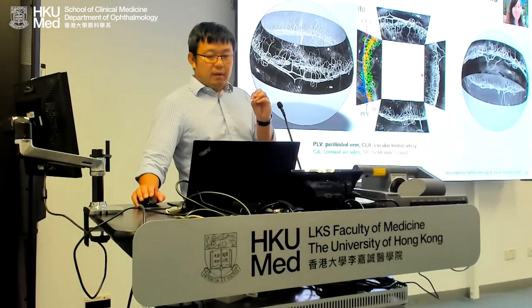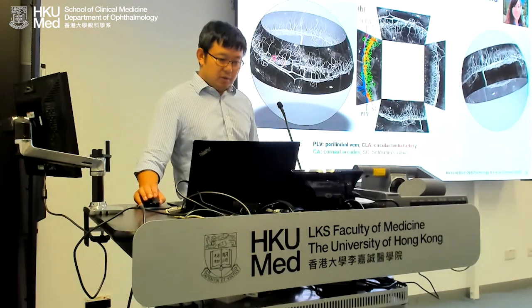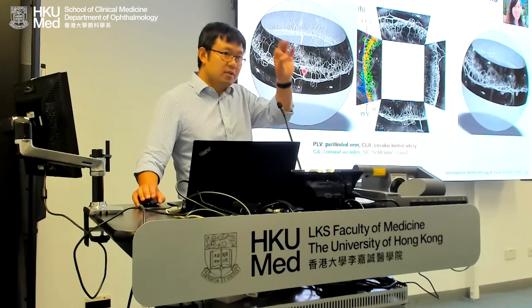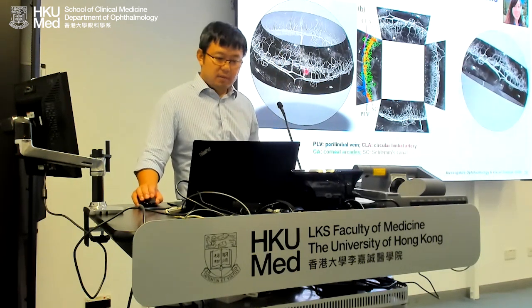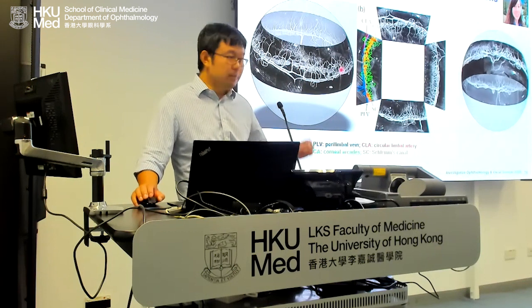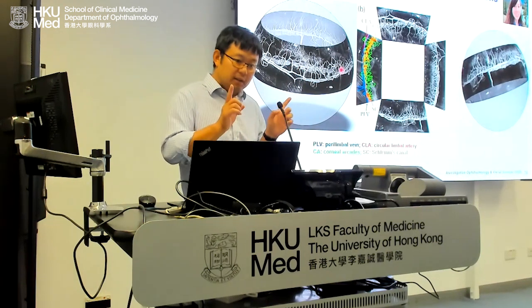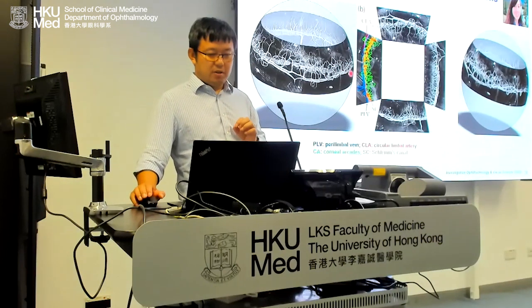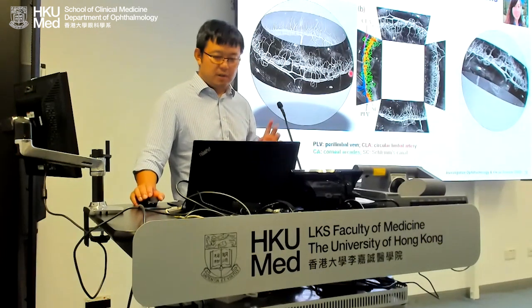And when everything is visualized better, you actually see that the gray, sausage-shaped structure is the Schlemm's canal, and all these vessels are the limbal network that drains everything. So at the time it was 2D. Lisa Beckman was the first author. She did a beautiful job.